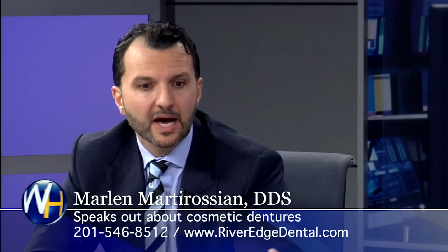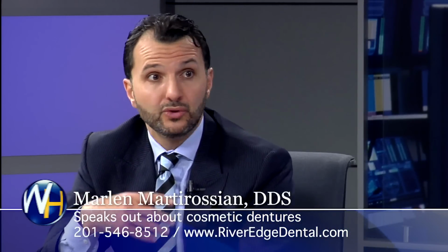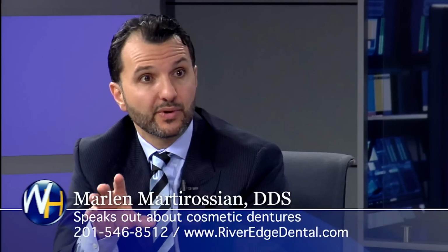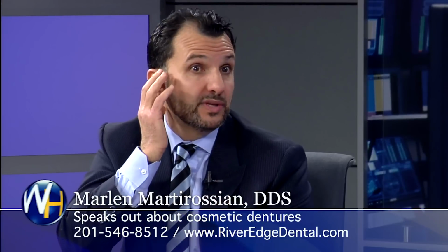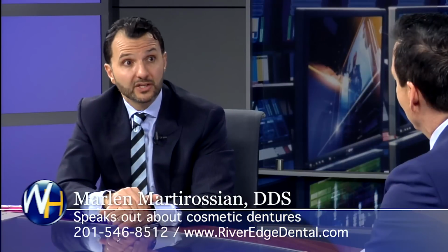So you mold the teeth based on how their teeth come together, in a comfortable position. Then you freeze it and make the mold from there? That's exactly how we do it. We adapt the new denture to the patient's facial profile and ultimately to the relaxed muscle. So live, when we take an impression and set up those teeth, we can actually see the position of the teeth where the joint is functioning properly, when the muscles are relaxed and in a more physiologic position.